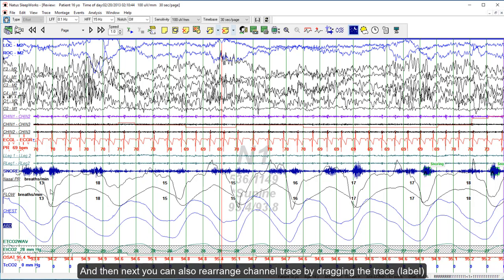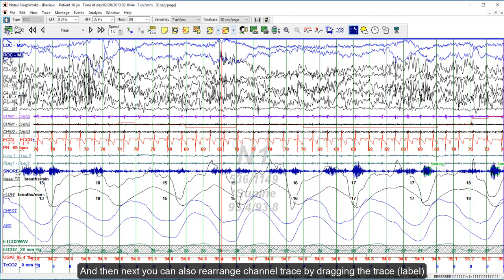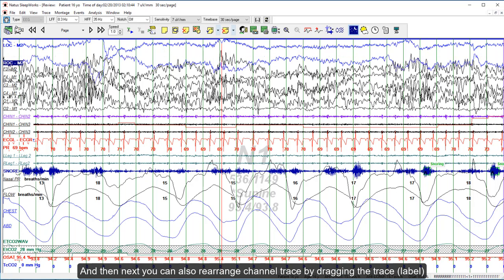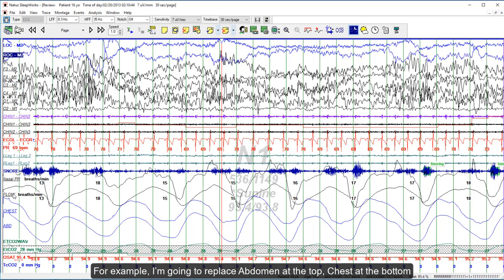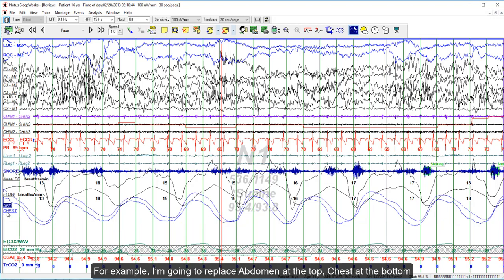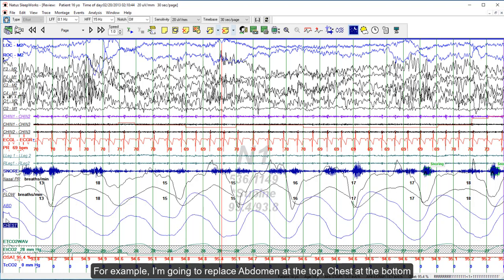You can also rearrange channels by dragging the trace. For example, I'm going to place abdomen at the top and chest at the bottom.